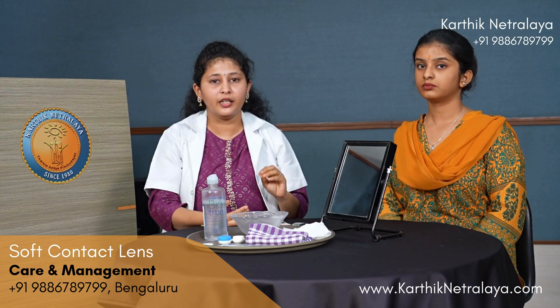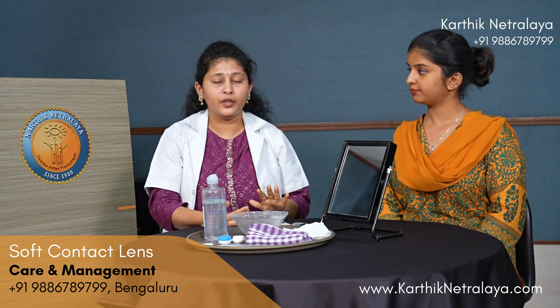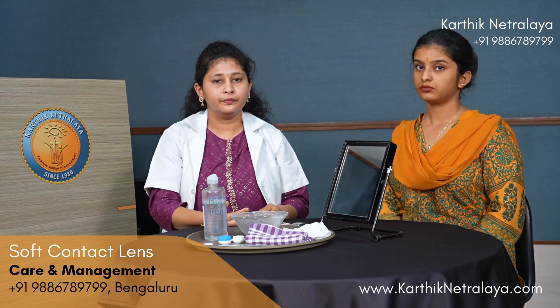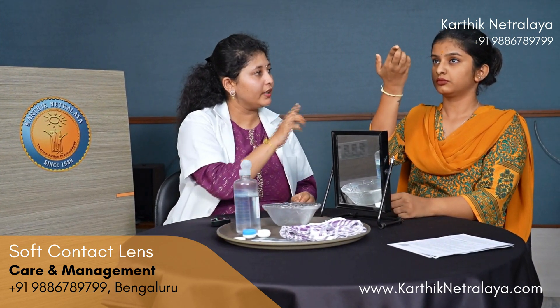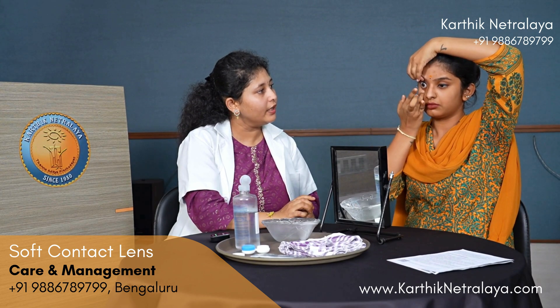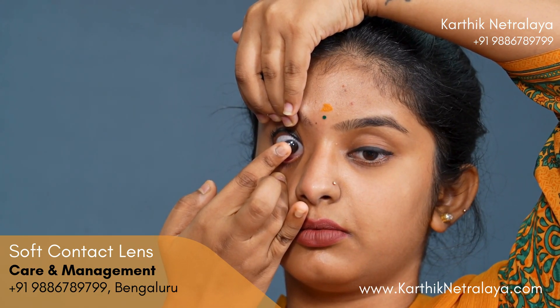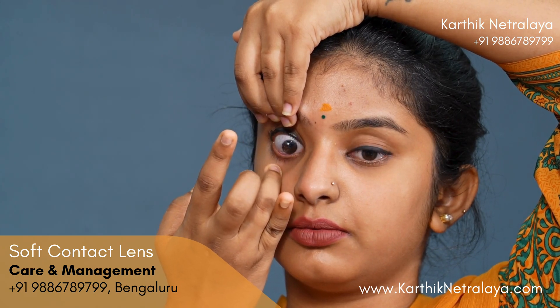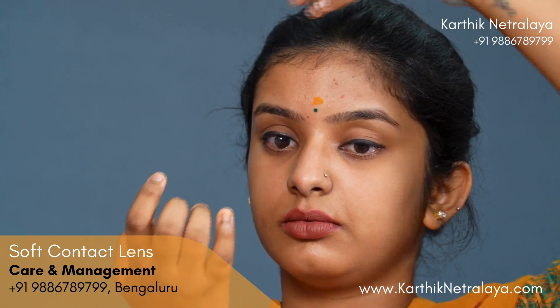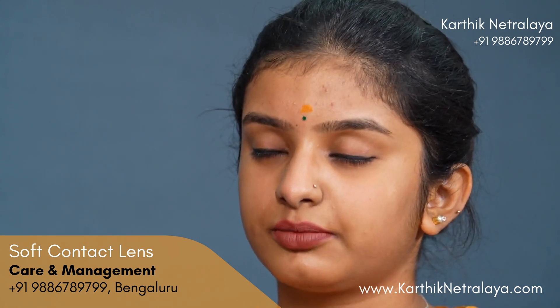Slowly release your upper hand and close your eyes. You will have some pricking, irritation, and burning for about one minute — close your eyes until you are comfortable, then open them. Now she will wear the lenses: hold the upper lid from the opposite hand at the lashes, pull the lower lid with the middle finger like a button. Slowly release the lower hand, then the upper hand, and close your eyes. You will have some burning and irritation for one minute; once comfortable, open your eyes.